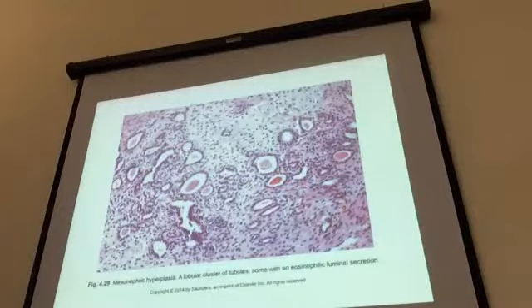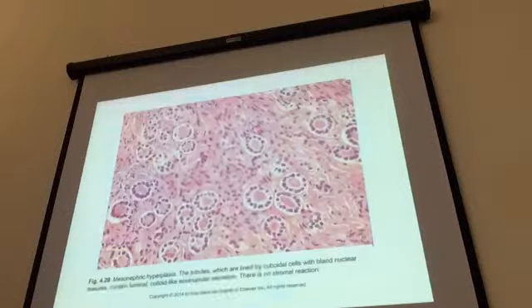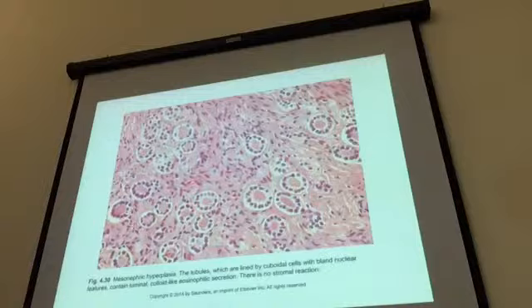Here's a high magnification. Again, you see the PAS positive secretion. And these are very low cuboidal cells, very bland appearing, but they're in an odd location that can raise concern. At higher magnification, you see somewhat clear cytoplasm and again, luminal secretion. So concern for well-differentiated carcinoma in a deeply placed lesion is understandable, but once you know the lesion, you quickly can dismiss that possibility.